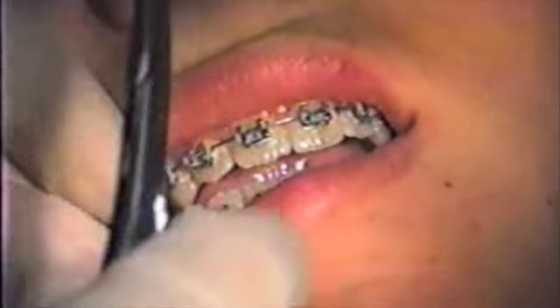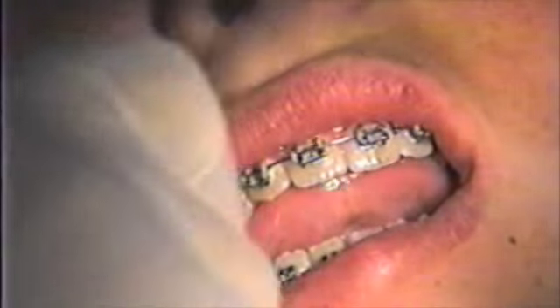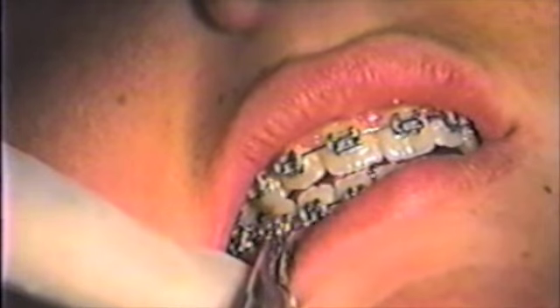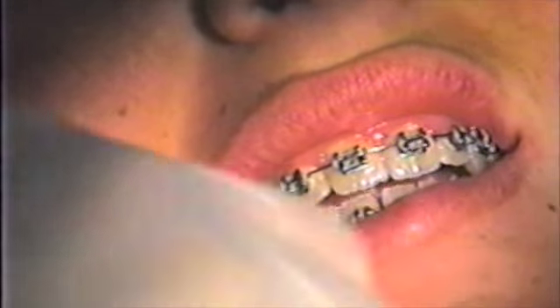I have had several adolescent patients who do prefer a safe spring over an elastic, merely because they do not have to do anything during the treatment month. A patient will have to eat with a safe spring in place, and it would seem rather cumbersome for that process, but I usually do not get many complaints in this regard.